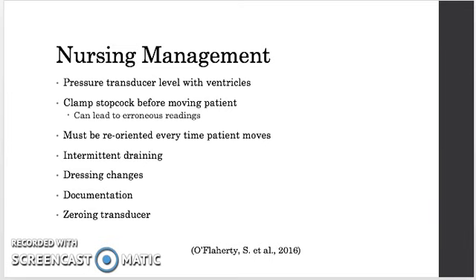And before moving the patient, it's essential that we clamp the stopcock. This is important because if the patient stands up, we will have a falsely high ICP. The CSF will drain too quickly. It'll go from the patient's brain into the drain, and we are left with a potential for collapse of ventricles, which is a medical emergency.